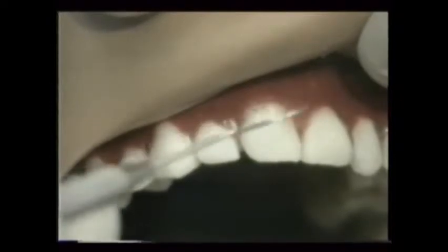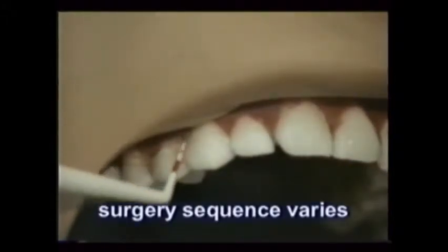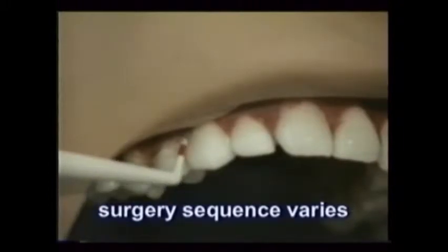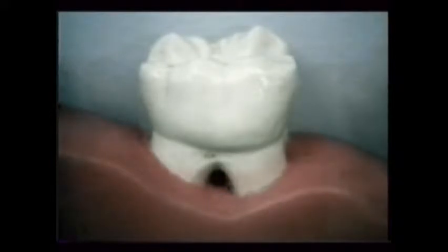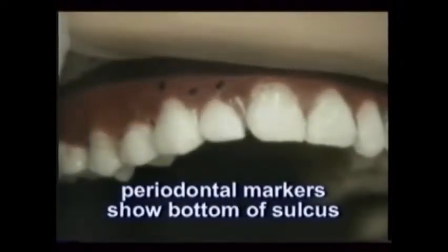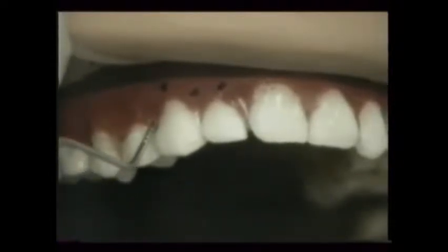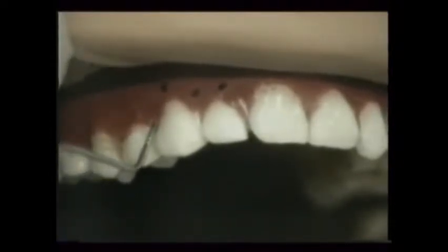The doctor first assesses the onset of anesthesia using a sharp explorer. The actual sequence of periodontal surgery varies depending on individual doctor's training and experience, but the goal is the same in all cases: remove diseased tissue and restore proper morphology. First, periodontal markers are used to show the shape of the bottoms of the sulcus around each tooth. They are inserted to depth and squeezed, leaving a small perforation in the gingiva.